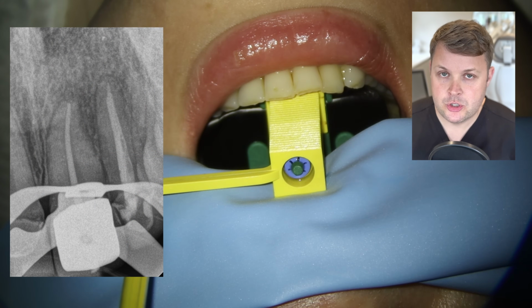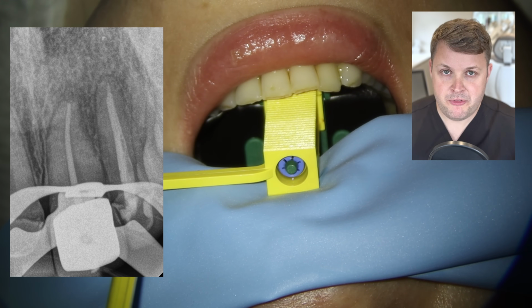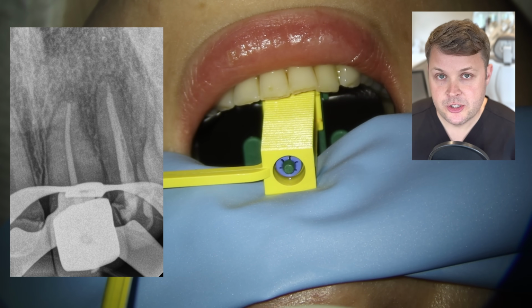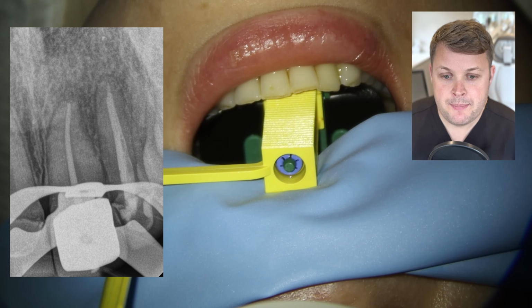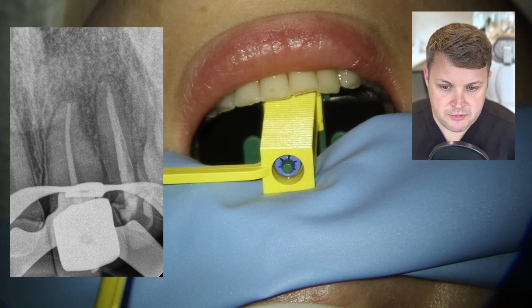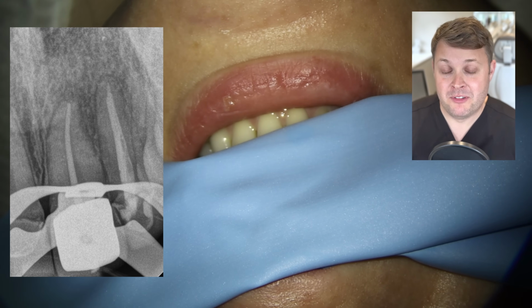And then I use just a normal ended PA holder here, because I feel like using a specific root canal endodontic holder kind of gets in the way, and because I'm using that kind of butterfly rubber dam clamp, the conventional periapical radiograph holder goes in the specific hole between the butterfly clamp essentially.